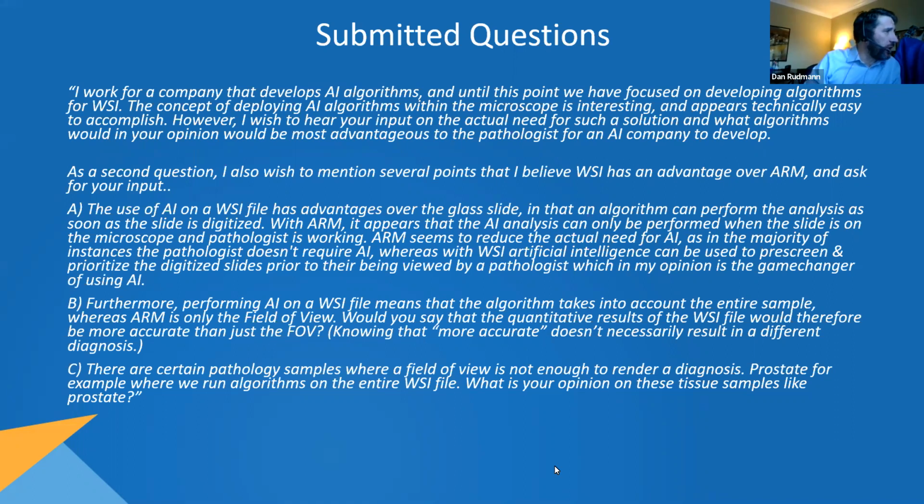And let's see. I think that covers field of view for us in preclinical toxicology. We look at a whole tissue section, so we aren't clinical pathology generally. Much of it is biopsy evaluation for good reason. We in non-clinical have access to the whole organ, which is a benefit for us in some ways, but it's a lot more tissue to look at.